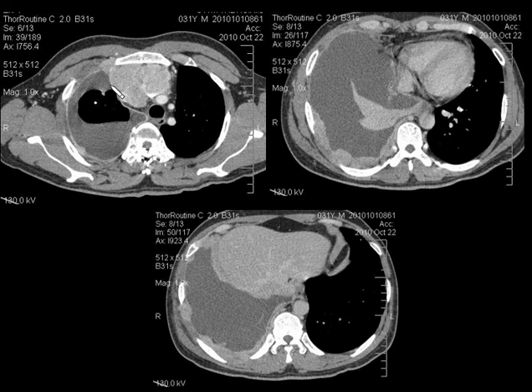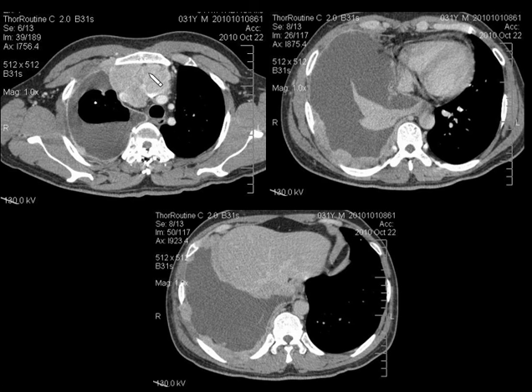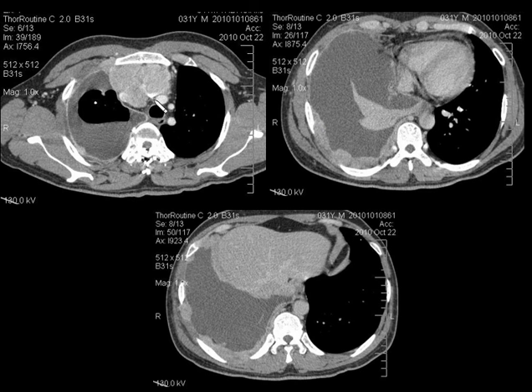Coming to the next spotter, you can see an enhancing soft tissue mass lesion in the anterior mediastinum insinuating between the great vessels, with moderate-to-gross pleural effusion and nodular deposits along the pleura. In this 31-year-old male, this is a classical case of thymoma with drop metastasis — this is not a seminoma or germ cell tumor because there are no calcifications or fat densities. Remember drop metastasis from thymoma to the pleura and lungs.